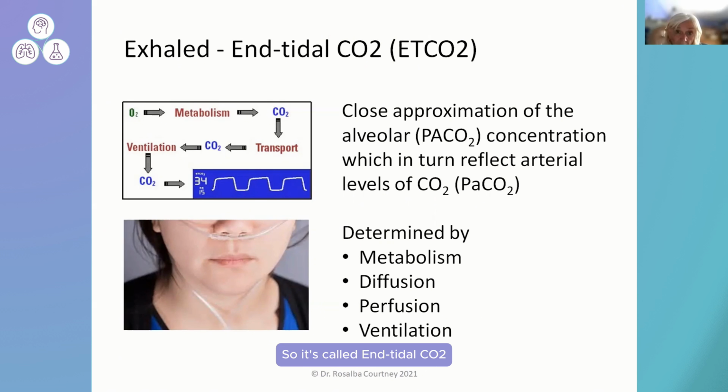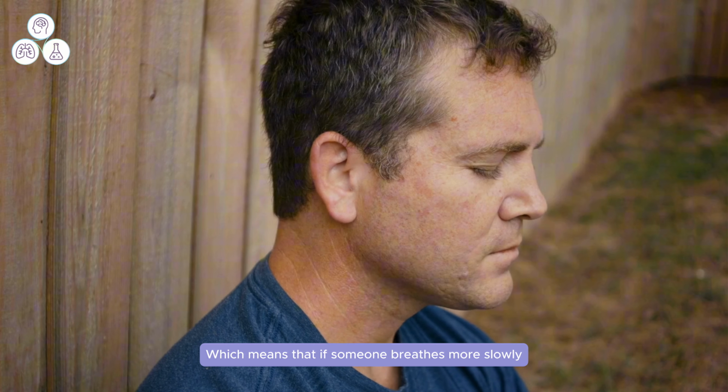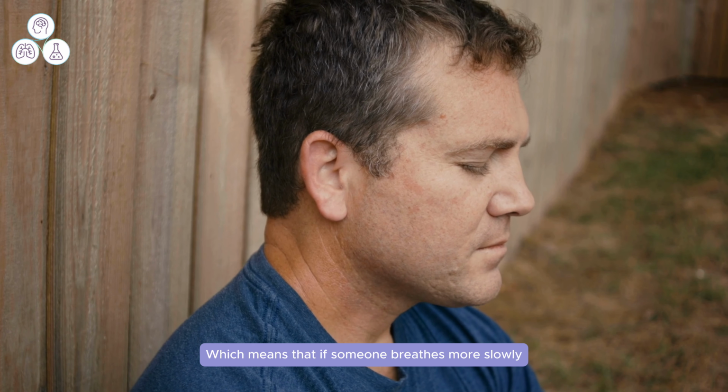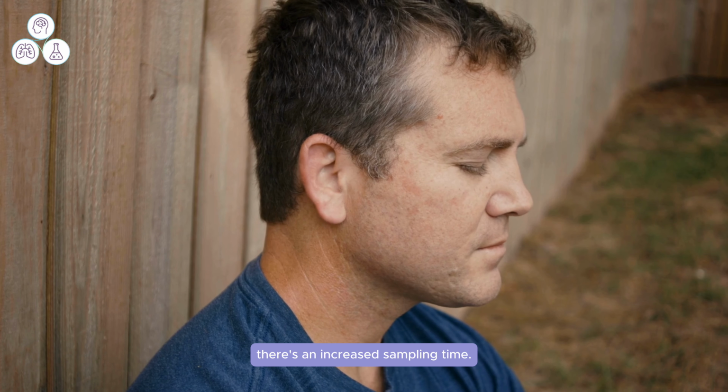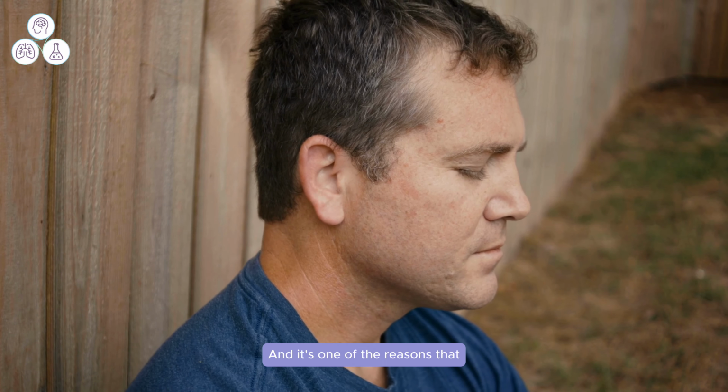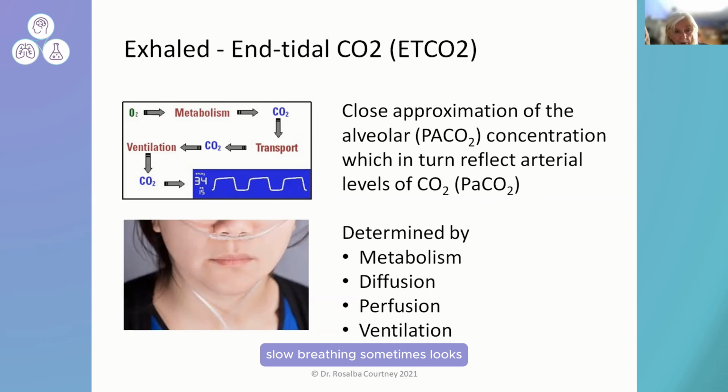So it's called end-tidal CO2 because it's actually giving you the measure at the end of the exhaled breath, which means that if someone breathes more slowly and makes a longer exhalation, there's an increased sampling time. And it's one of the reasons that slow breathing sometimes looks like it's giving you higher CO2 than is actually going on in the body. You've just got this increased sampling time with a longer, slower exhalation.